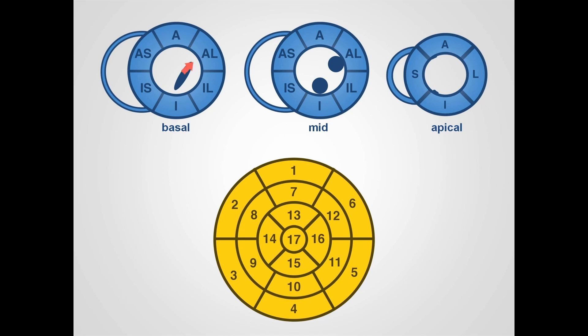Basally, we have the mitral valve orifice represented here, and we have six segments of the left ventricle: the anterior, anterolateral, inferolateral, inferior, inferoseptal and anteroseptal segments. We define the septal segments in relation to the position of the right ventricular free wall.